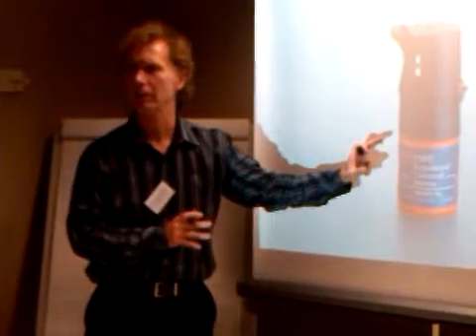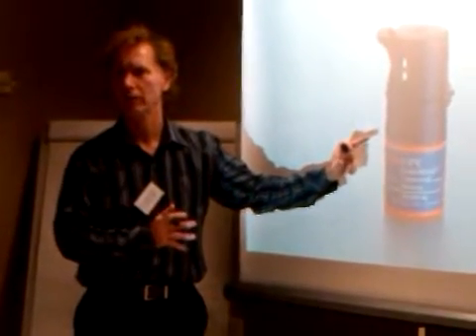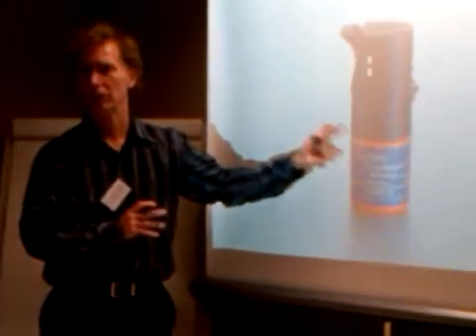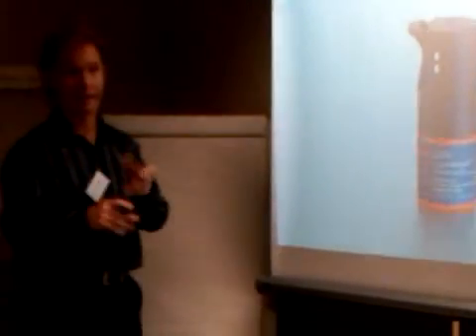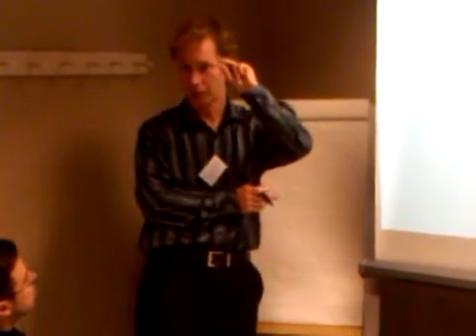It's lightly filled. What percentage filler is it, John? About 10. Okay. Lightly filled bonding agents hold up better. Why? They don't wear out. So I want a light filler in there, and it has microparticles, not those big ones.